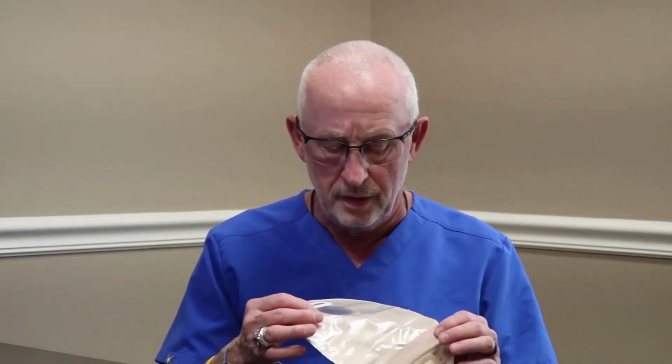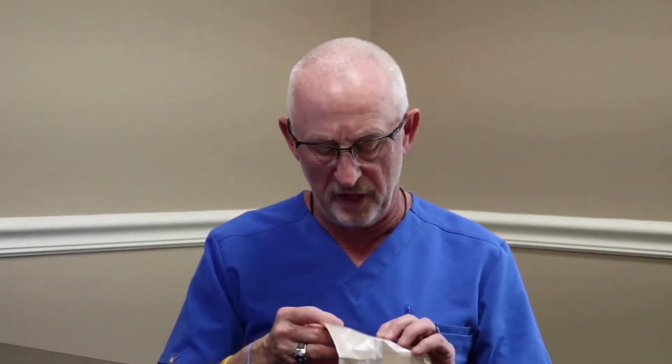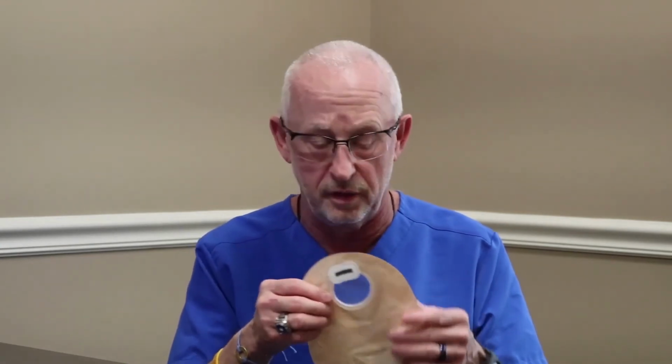Obviously, odor can be a problem. I know, not from personal experience, but from the patients I've taken care of, there are a variety of products that help with that, from stuff you put in the bag to filters. This bag has a little charcoal filter on it that helps deodorize the gas that comes out. Just the sound of passing gas can occur, and of course that could happen to any of us, maybe heard in the movie theater just having a regular fart. But it certainly can occur with this that people will hear the sound of gas coming out of the ostomy.